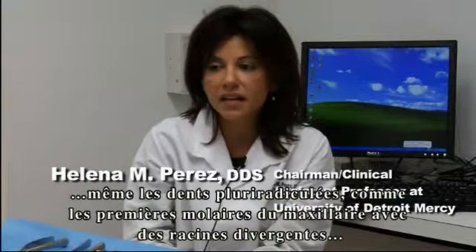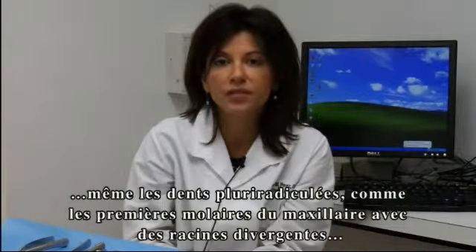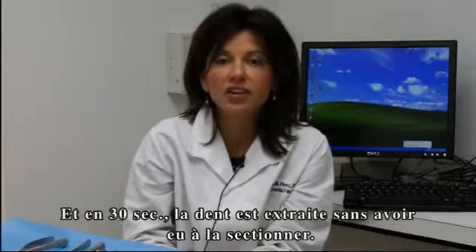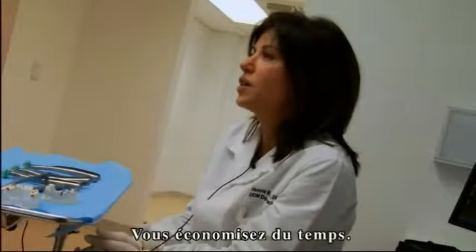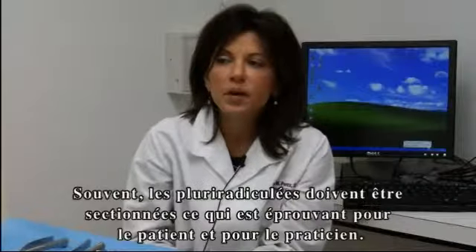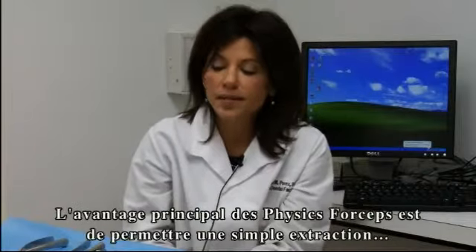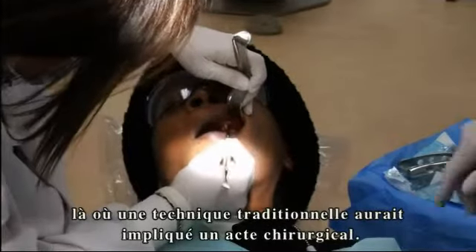I find that even multi-rooted teeth — for example, maxillary first molars with divergent roots — you set the beak and the bumper on the tooth, you start your rotation, and after about 30 seconds the entire tooth will be elevated without having to section the tooth, which saves you time. It also saves trauma to the operator as well as to the patient. Often multi-rooted teeth have to be sectioned, and that can be more stressful for patients as well as for the doctor. The major advantage is doing simple extractions where they would have been surgical otherwise.